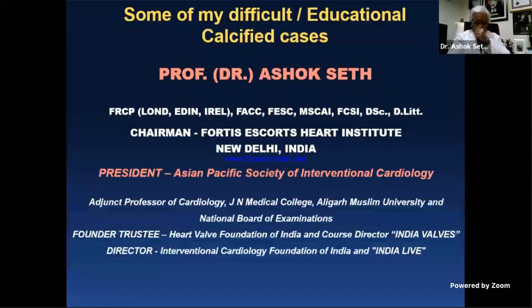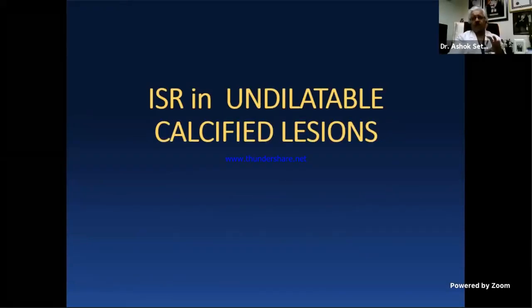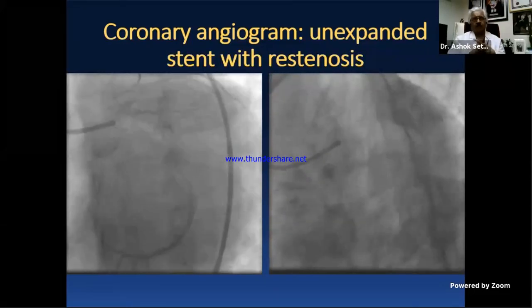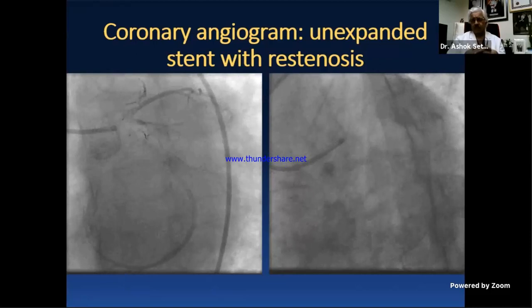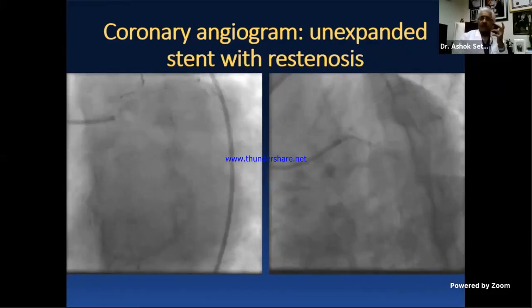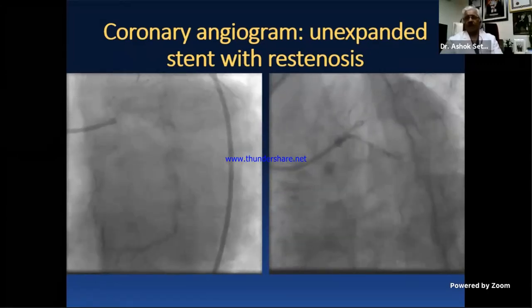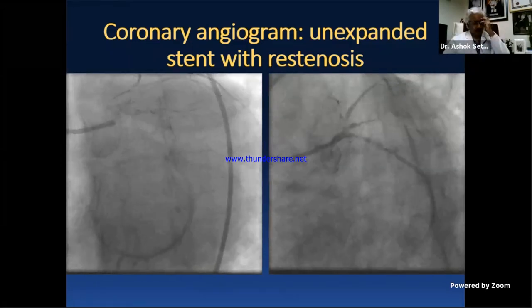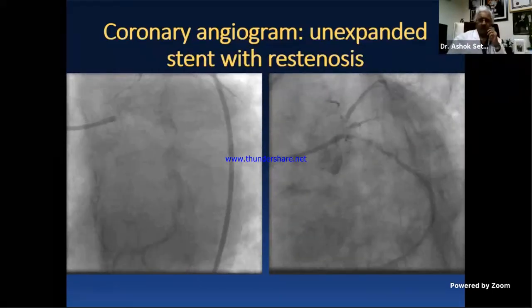So what I'm going to talk about is a spectrum of cases, pointing out many of the things which have been discussed and truly representative of some of the aspects which have been questioned also. In 2011, we explained a number of times: do not implant a stent until the lesion is completely dilated in a calcified lesion. That should perhaps be the number one message I'd like to give to the audience. We've done that repeatedly, and yet even to date, we ourselves occasionally, by mistake, believe that a lesion is pliable and will dilate well, implant stents, and find we've got an under-expanded stent. Regularly, under-dilated stents put in a heavily calcified lesion without adequate predilatation are referred to us.